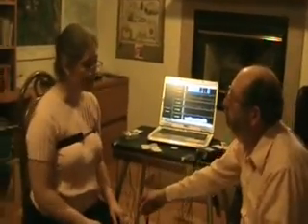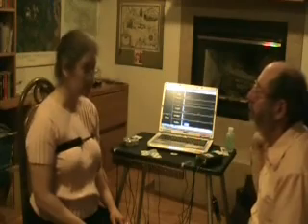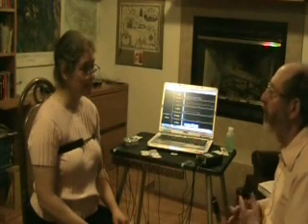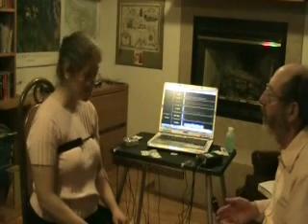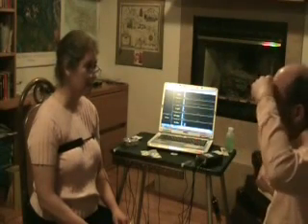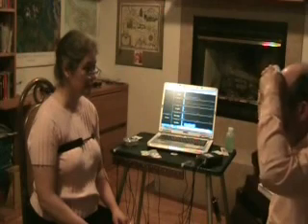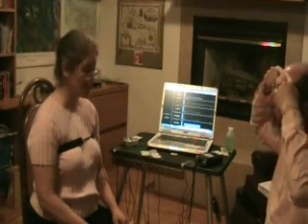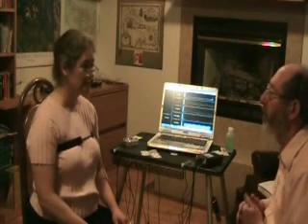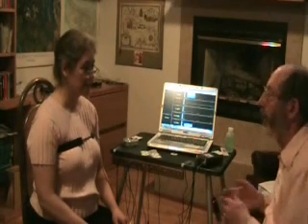what we're going to do is record muscle tension from your forehead and from your shoulder. Your muscles produce electricity. As they get tenser, they produce more electricity. So we're simply picking up the amount of electricity your muscles are making. The reason that we're interested in recording from your forehead, the forehead muscles run vertically. So we're not really picking up the tension in your forehead, rather we're picking up all the electrical noise that's getting across your forehead. And that electrical noise is picked from your jaw and other areas in your head that are very sensitive to emotions. And since this is a stress profile, if you become more relaxed, the electricity should go down. If you become tenser, the electricity should go up.